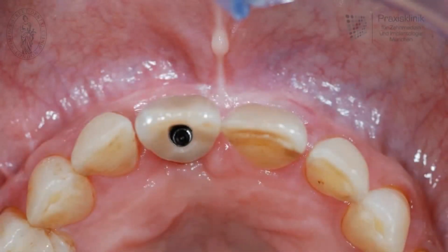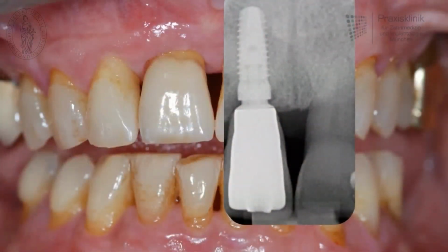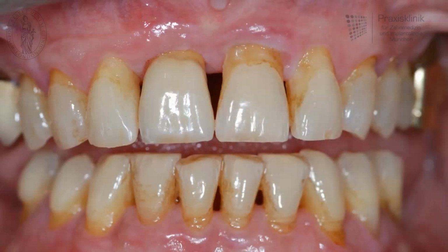In this picture we see in the top view the screw access hole on the palate side of the crown. This will be covered by a composite resin, and after polishing it is clearly invisible. And in this X-ray image we can see the sufficient position of the implant and a very healthy bone around the implant. And if we have a view without the X-ray image, we can see that we have a very aesthetic and a very natural result.